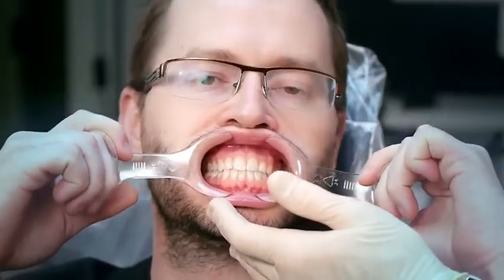We're going to use plastic retractors, and in the previous lesson we talked about how to use these. So Scott's got some Vaseline on his lips, and we're going to insert the retractors here. And will you take that, Scott? And now will you take the other side? Now bite together. I'd like you to turn towards me a little bit.